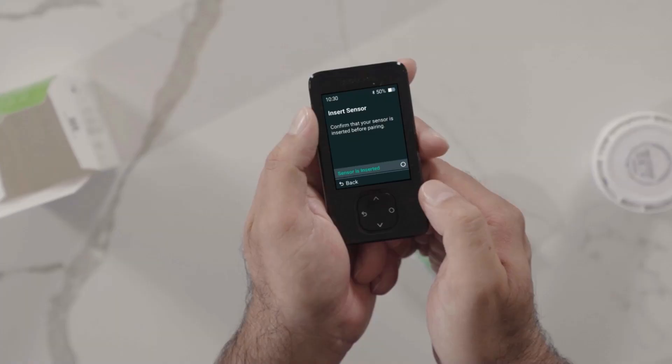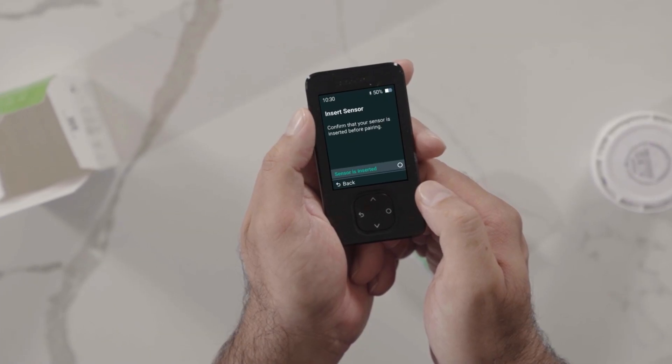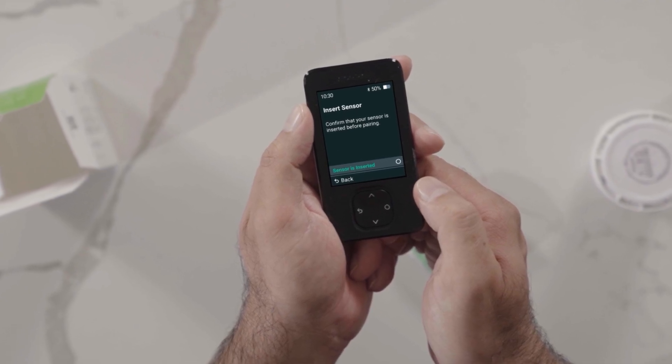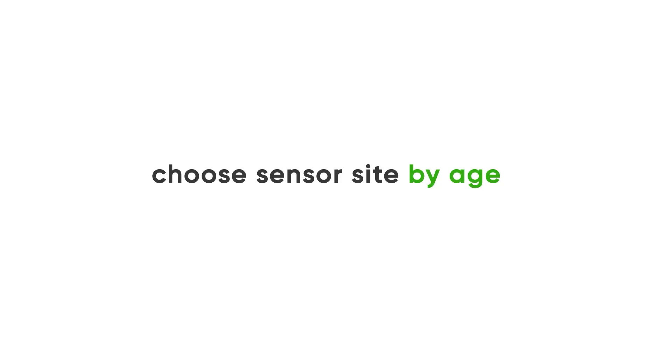After learning all about your new G7 system, it is time to insert your sensor. You will see the Insert Sensor screen at this point. For printed instructions on how to insert your sensor, see the instructions in your sensor box. To insert your sensor, first choose your sensor site.